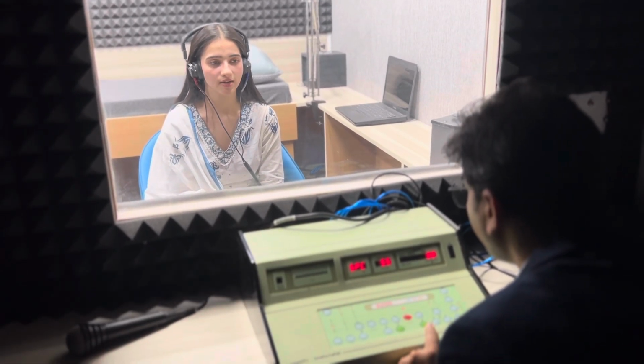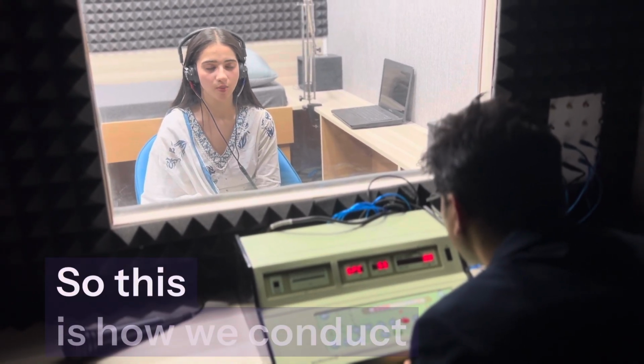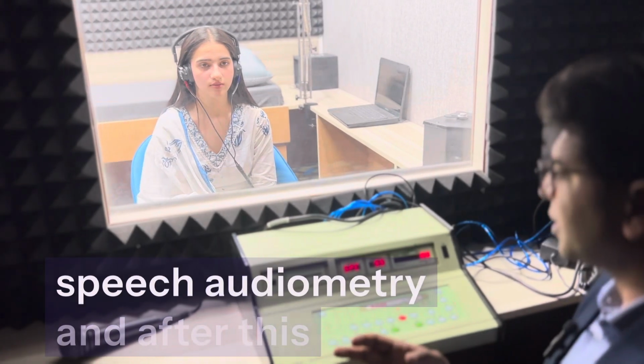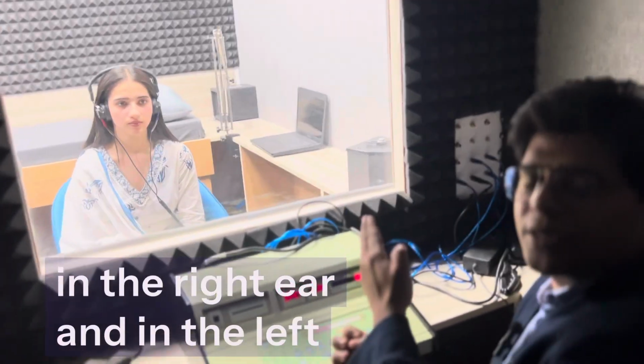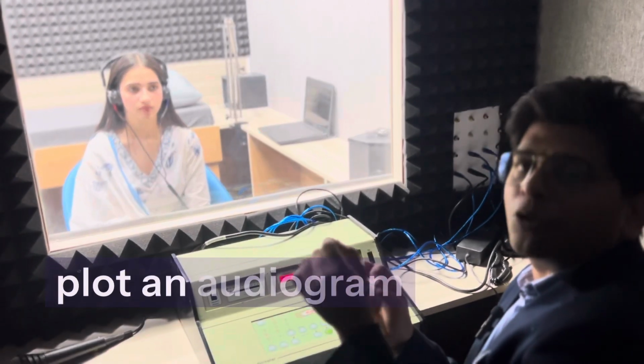Sunset, blackboard, cowboy. So this is how we conduct speech audiometry, and after this we are going to conduct audiometry in the right ear and in the left ear, and based on that we are going to plot an audiogram.